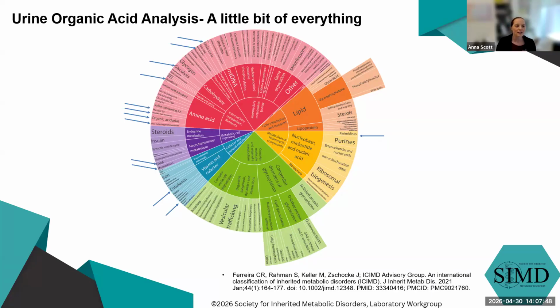This was untargeted testing before metabolomics was a hot topic. Urine organic acids was here in the clinical lab supporting metabolic disease. And we very well may see a lot more in the mito realm. I don't know if you can see my mouse here, but upper red part of this diagram, there's a good chance we will see biochem markers in urine, likely nonspecific, but basically the stuff that I've highlighted here are things that I know for sure we can see something, and we are still learning all the time about abnormal metabolites that are accumulating.